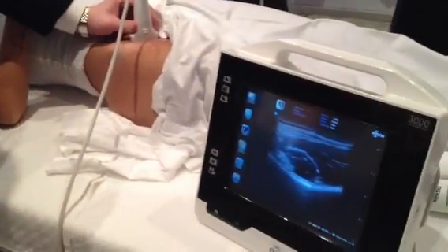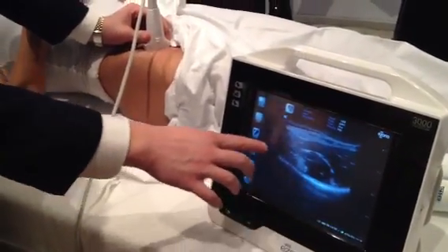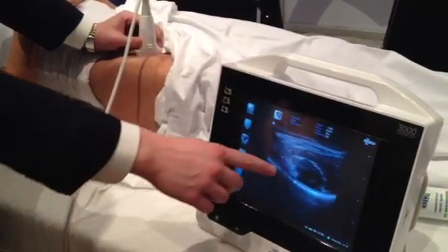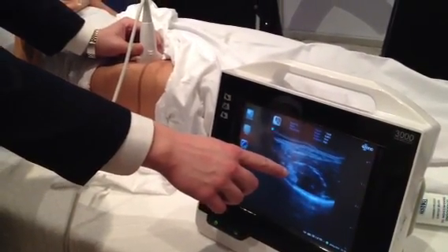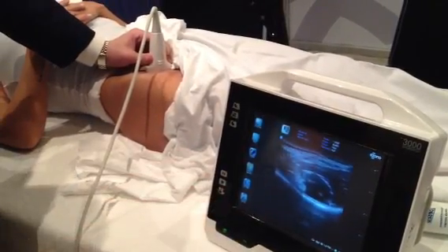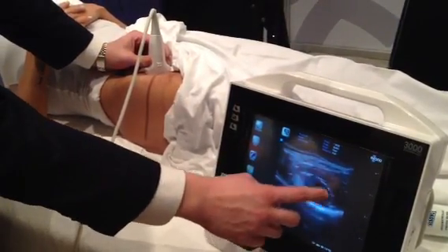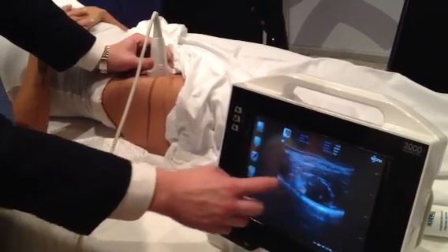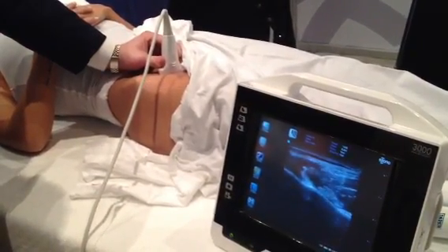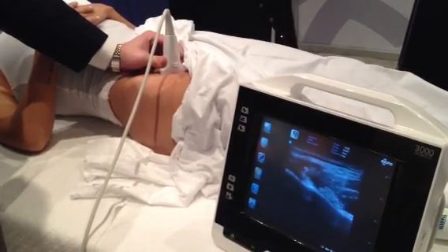The first thing we're going to see is a nice bright hyperechoic line, which is the pelvis. Right above that we see this grayish figure which is the iliopsoas tendon, and then the iliopsoas muscle around it. Now if I go just a little bit medial, I see the pulsating femoral artery.